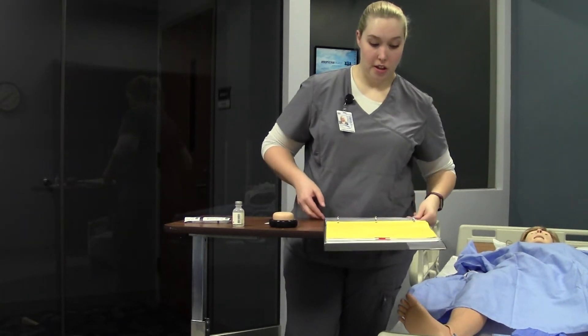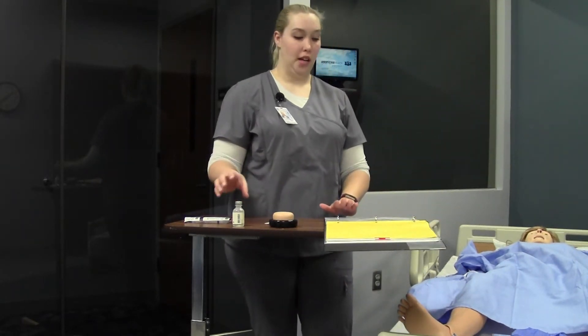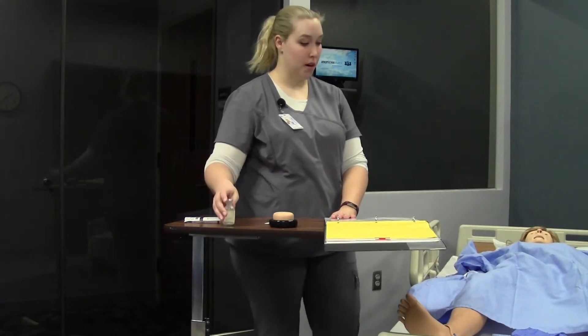Heparin, 5,000 unit sub-Q. I'm going to then pick my medication, 5,000 unit, it's perfect.